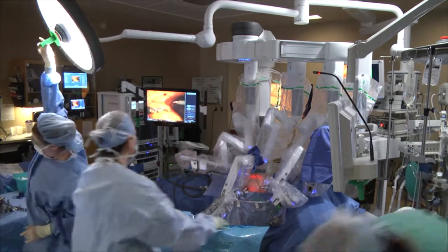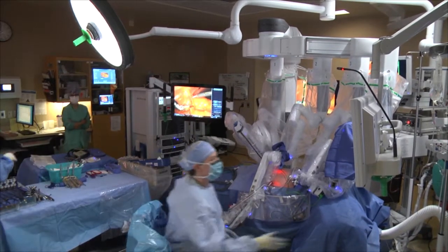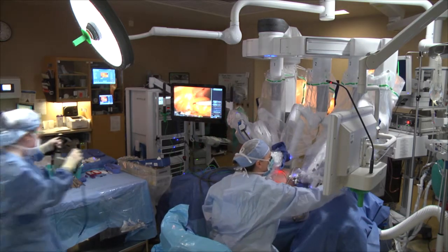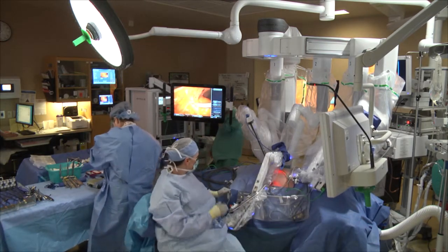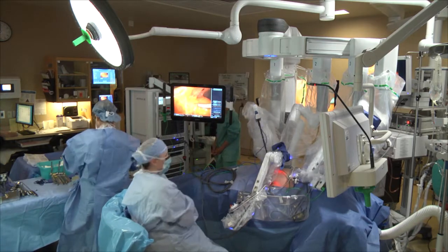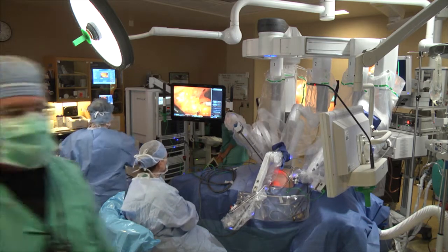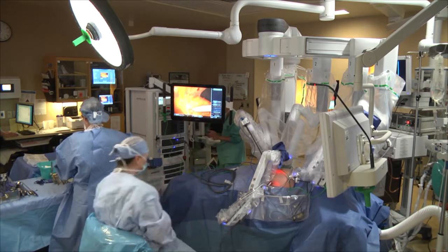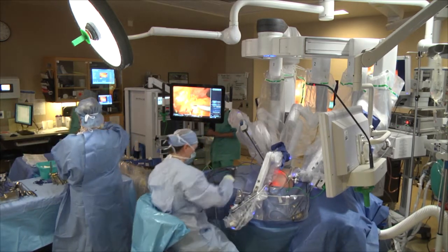Welcome back, Ronnie. Clayton and I are here. We're going to just read through the patient slide. So with this 57-year-old who basically fell and sustained a rib fracture, the CT of the chest incidentally found a renal mass. I guess the patient elected against surgery, and they were following this, and the MRI subsequently demonstrated a little bit of growth. It's now 3.8 centimeters. They spoke to the medical oncologist, and they were referred for surgery. Seems like the BMI is about 24. History of lung surgery, fairly healthy otherwise. And here we have the images.